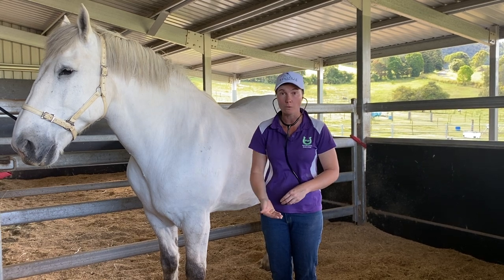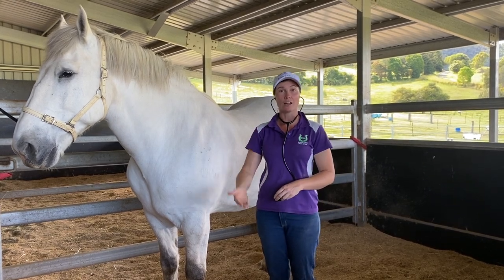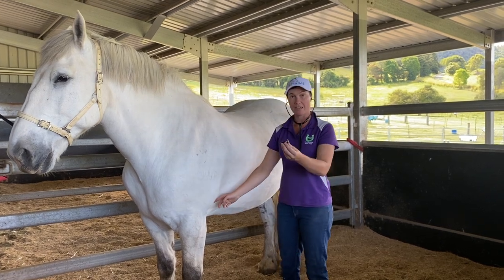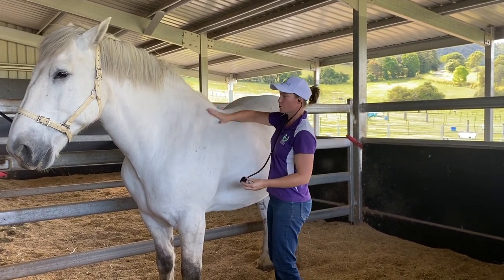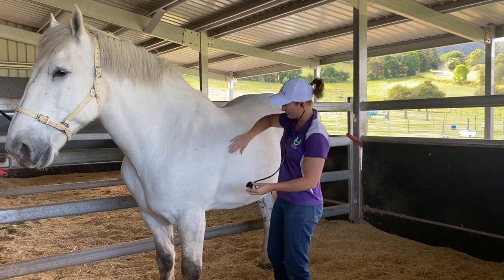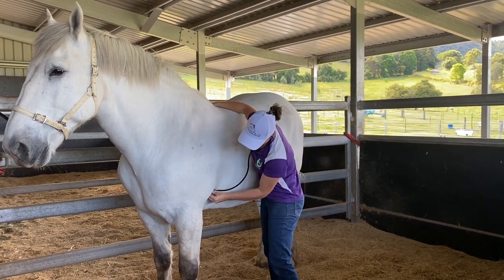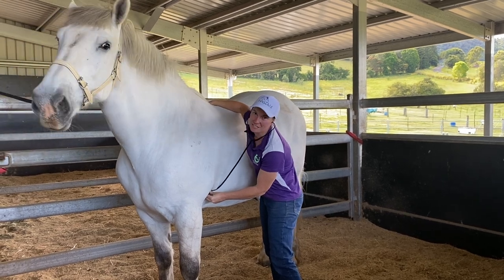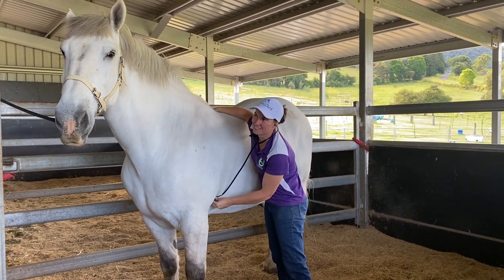Unless you have a foal, and that is between 80 and 100 beats per minute. So I'll just demonstrate again — find the point of the elbow, take the large part of your stethoscope, let your horse know that you're coming so you don't frighten him, and just place it just there. He's got a lovely slow heartbeat, these draft horses. Thank you.